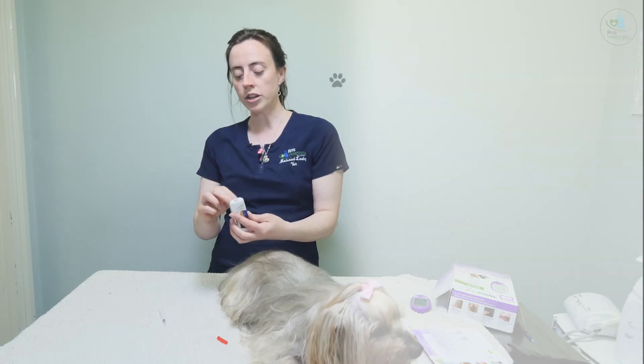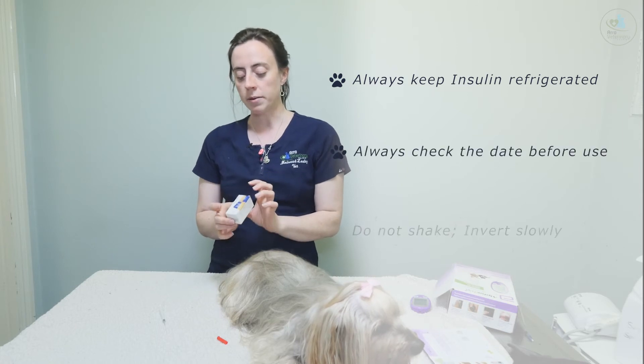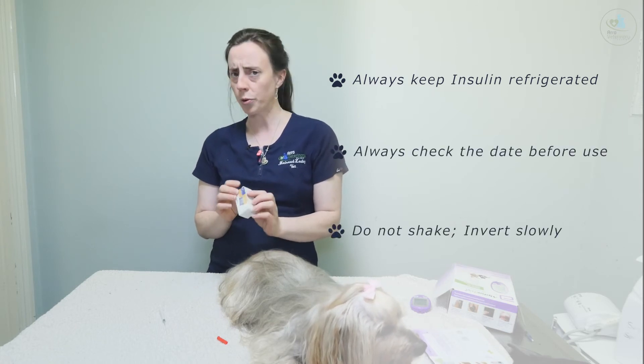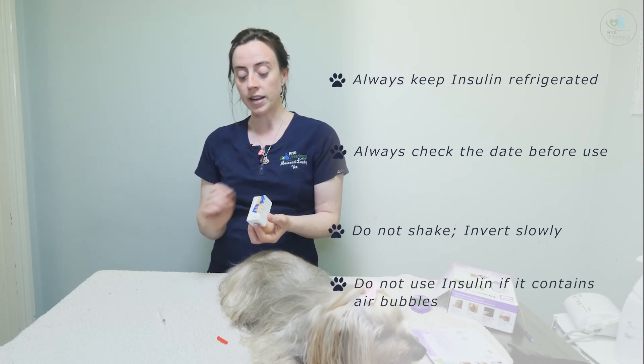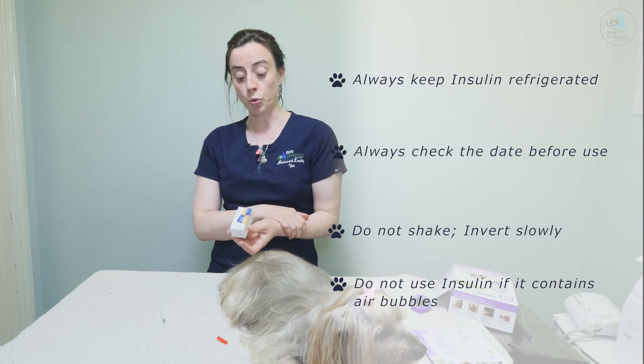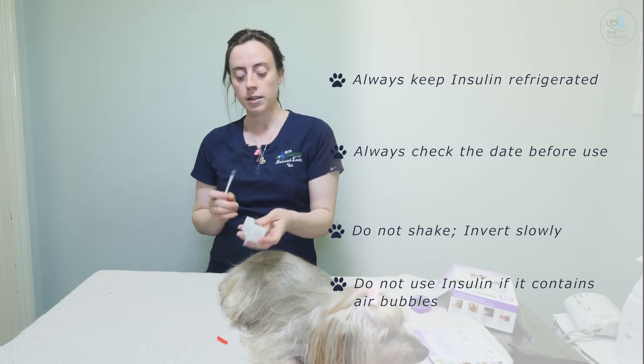Always store your insulin in the fridge. Always keep an eye on the date — don't let it be open for more than, I think it's four weeks for this insulin. And if there are any air bubbles, don't use it. You can't have air bubbles in it.